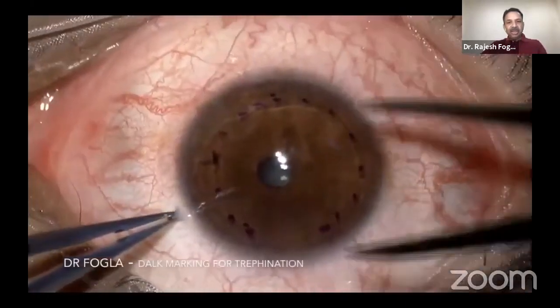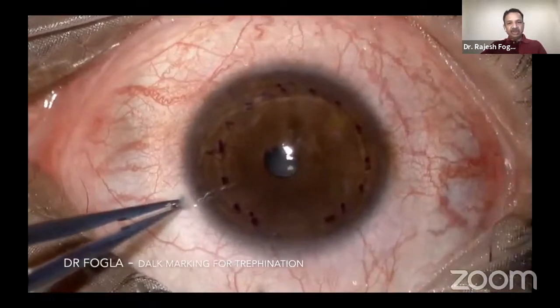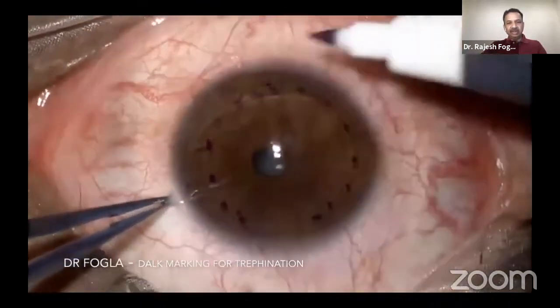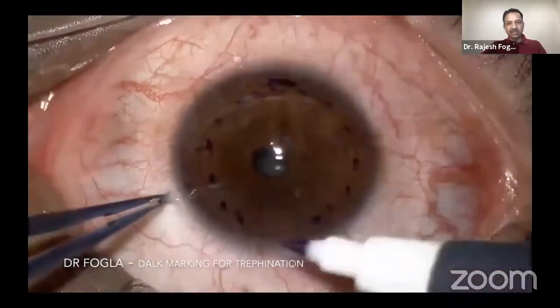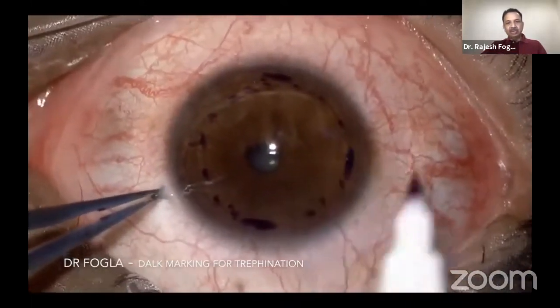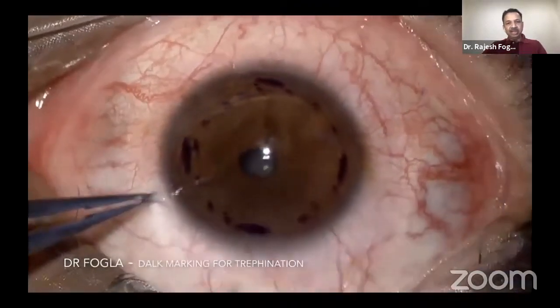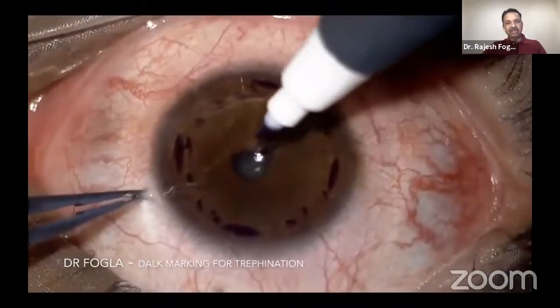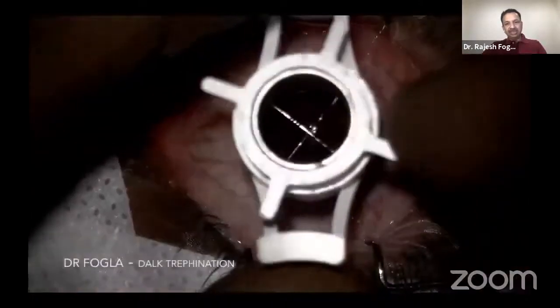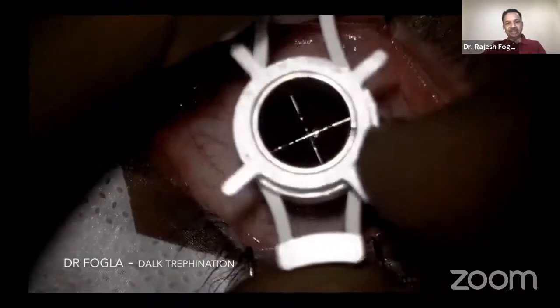In terms of making the mark, I like to use a pair of calipers and make 2 marks, horizontal and vertical, using the desired trephination size. Like in this case of post-LASIK ectasia, I'm using a trephine of 9 millimeters. So I make my 2 horizontal and 2 vertical marks. And then when I put my suction trephine, I try to touch all these 4 points rather than just trying to follow a central mark, which can sometimes give rise to parallax error and you can have an eccentric trephination.